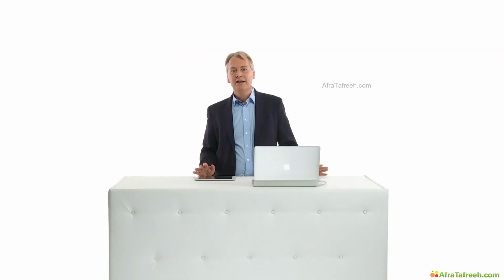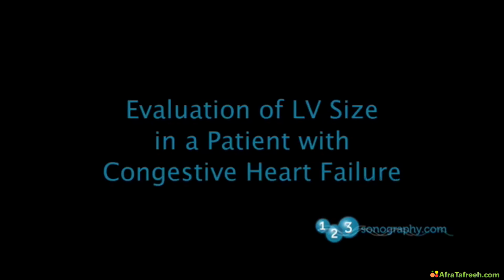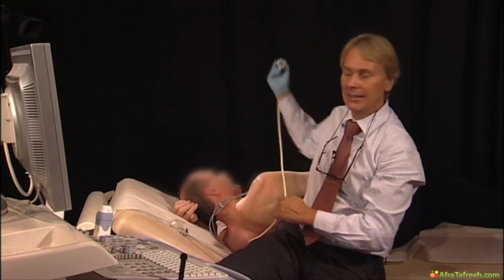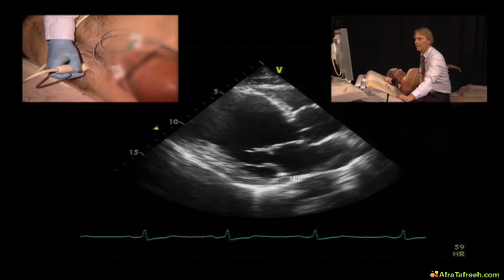Sometimes you will see that heart failure develops over time. But now let's go to a patient and see how we actually evaluate a patient with dilated cardiomyopathy. This is how I would quantify left ventricular function and left ventricular size in a patient with cardiomyopathy.